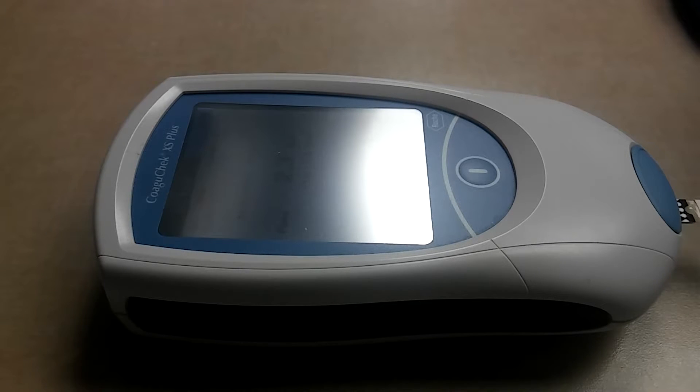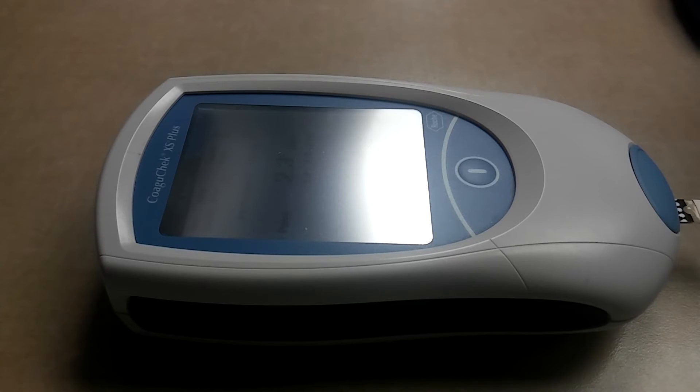I hope you guys found this video informative and helpful in case you have to run a Coaguchek XS Plus or another finger stick pro time handheld instrument. They're helpful in point of care. Some nurses perform tests on them, some medical technologists, and some phlebotomists too. In ER situations they may perform a finger stick versus a venous stick for a pro time. If results need to be done rapidly, as in a stroke situation, they try to perform them on this finger stick first.